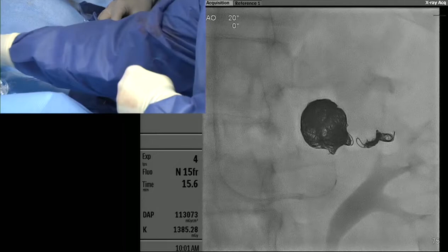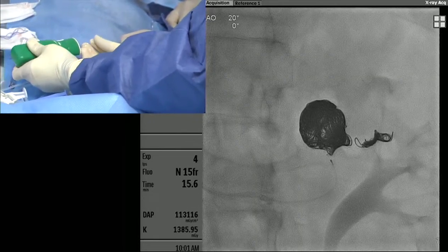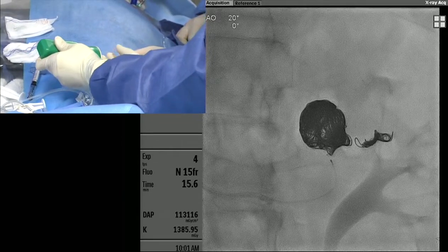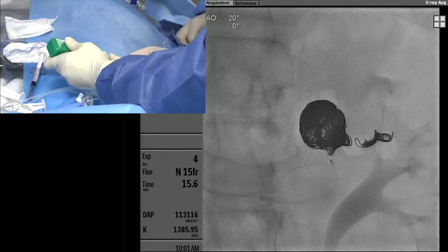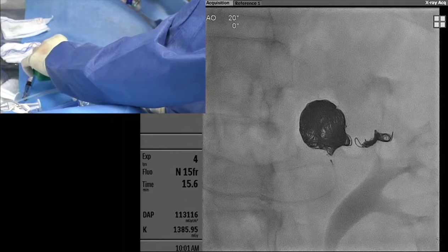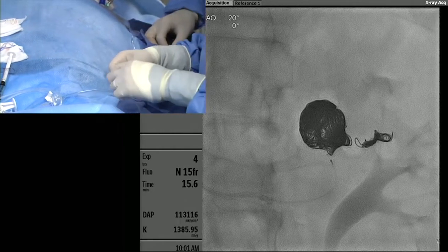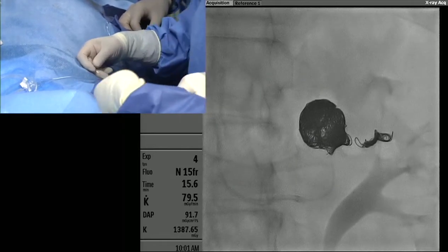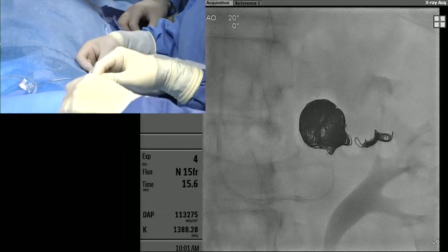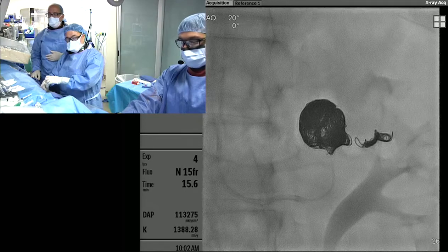We're filling up the inflow and we don't want to be too aggressive trying to force it through. We're making sure it contours to the shape of the aneurysm into the inflow vessel very well, using those attributes of this coil. With this kind of anatomy, if you use something too stiff you risk injuring the patient, so we want something very atraumatic.